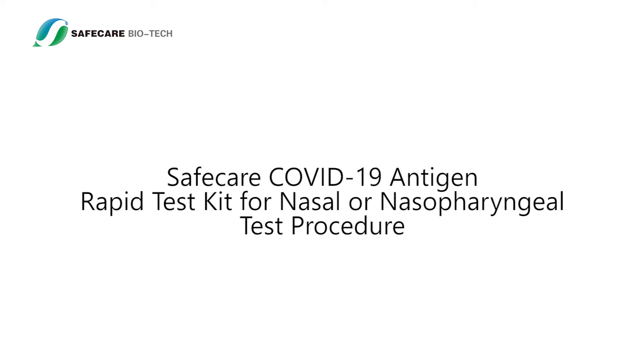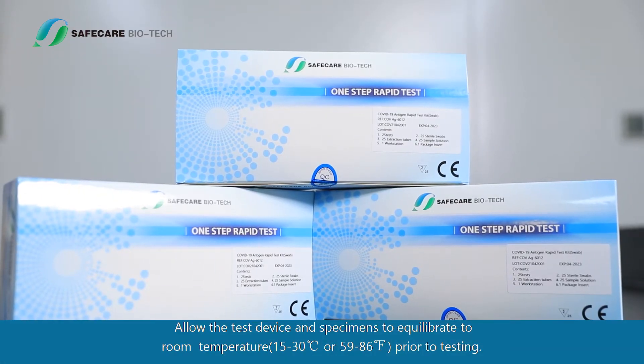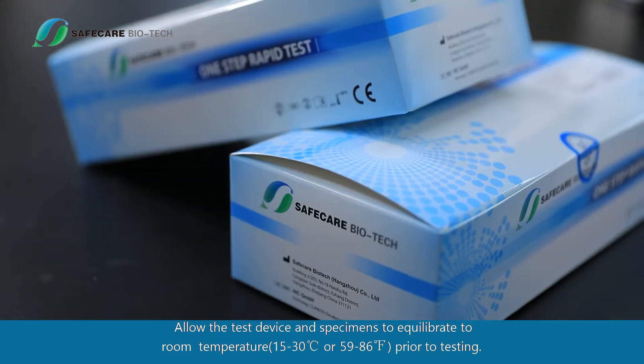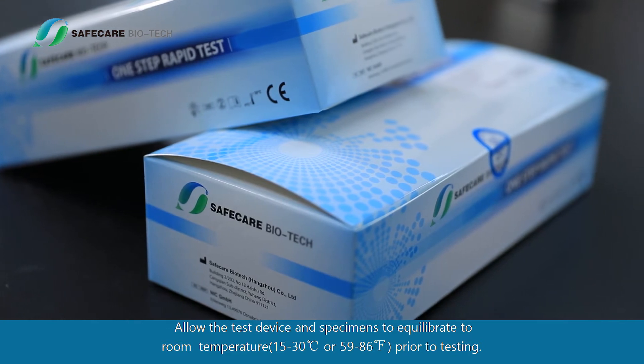SafeCare COVID-19 Antigen Rapid Test Kit for Nasal or Nasopharyngeal Test Procedure. Allow the test device and specimens to equilibrate to room temperature, 15 to 30 degrees Celsius or 59 to 86 degrees Fahrenheit, prior to testing.